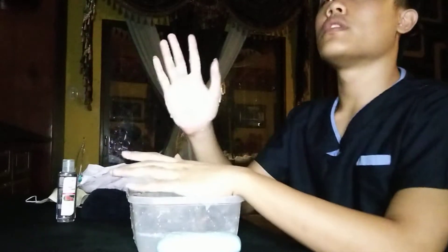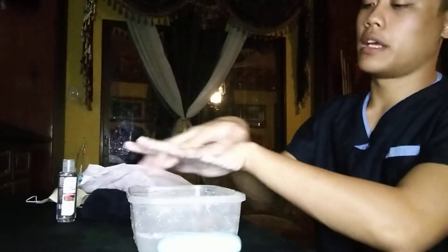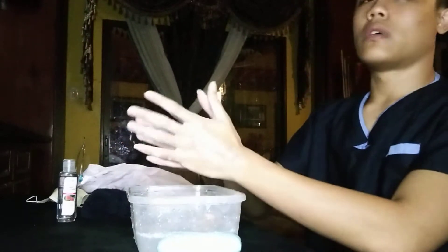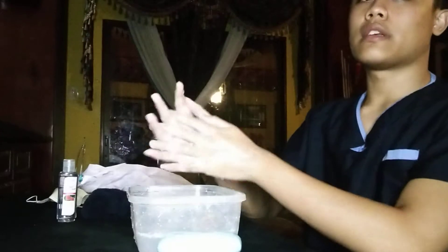Fourth, your right hand should be over your left hand, interlaced, and vice versa. Next, do palm to palm rubbing interlaced.